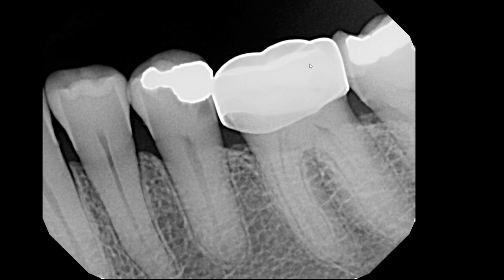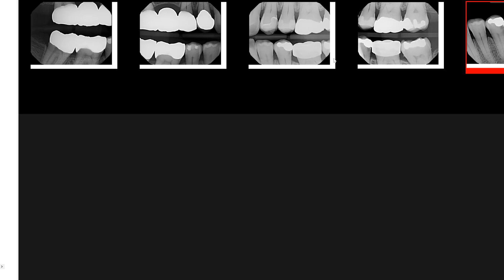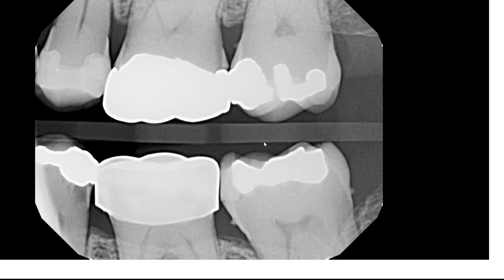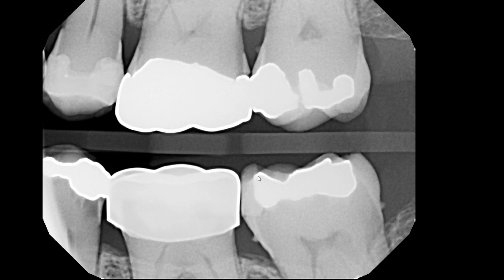Let's take a look at another view of this crown. Now we're looking at a bitewing, and again we can see that very smooth outline of the crown. The shape or size of the crown does not have that smooth emergence profile that I was referring to.